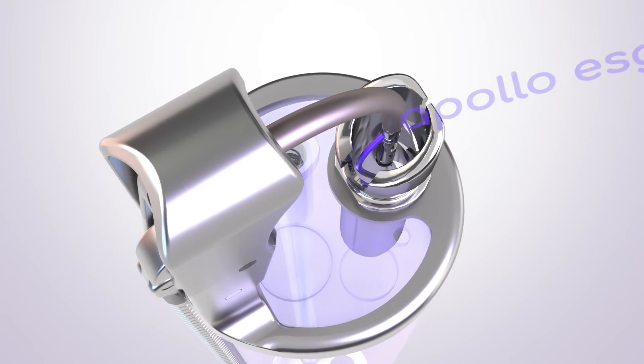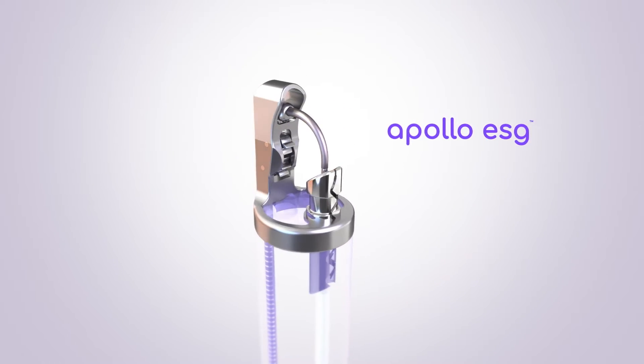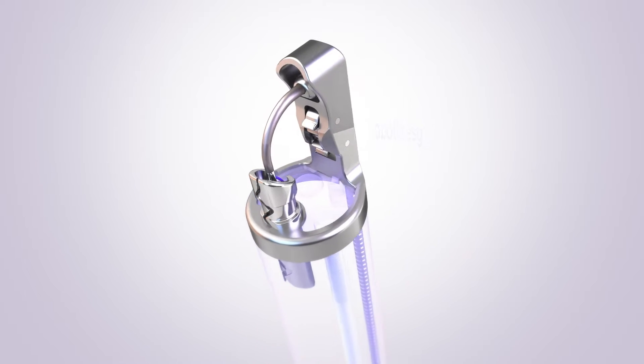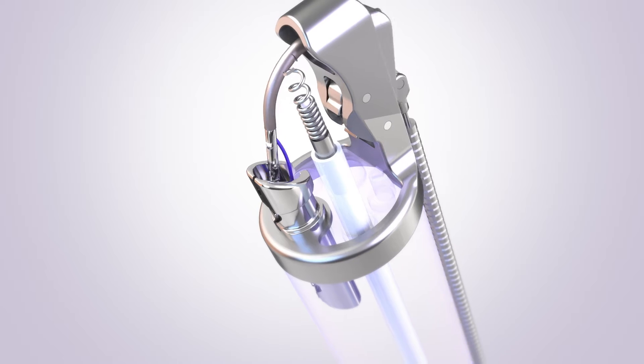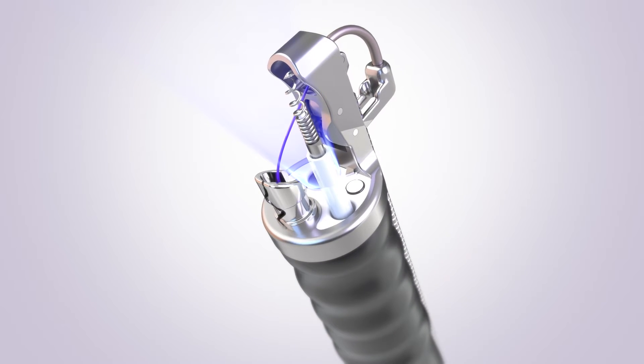ESG is performed using the Apollo ESG system, the first and only device authorized by the FDA for this procedure. The Apollo ESG system is a small endoscopic suturing device about the size of your finger that attaches to the end of an endoscope or camera.